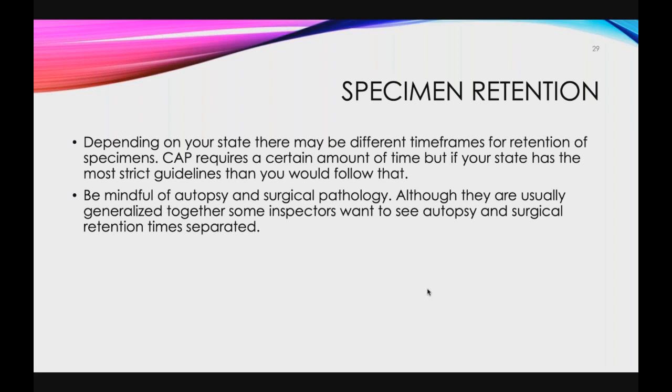That was a ding that we got. I had everything all on one, and they said, what about autopsy? And I said, that's all part of pathology. And they said, no, we want to see it separated out. And then they explained why. We have different requirements. Autopsy we consider separate from surgical pathology. So just keep that in mind.